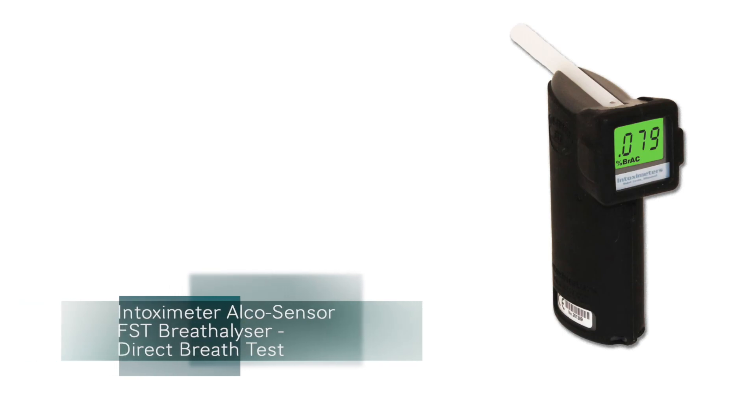This concludes a direct breath test on the Intoximeter AlkaSensor FST Breathalyser product and user guide.